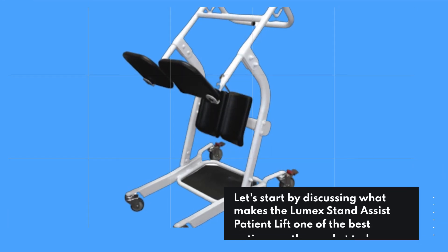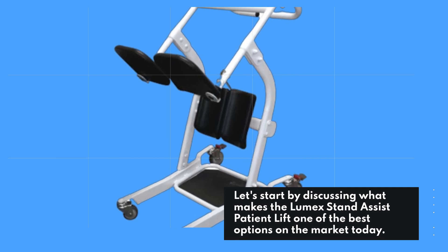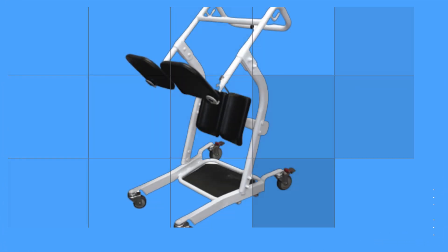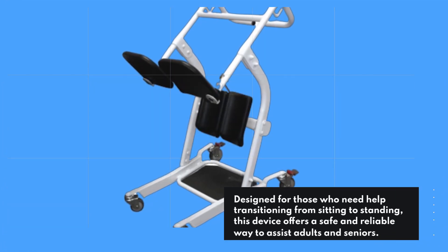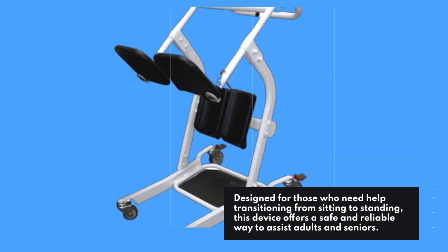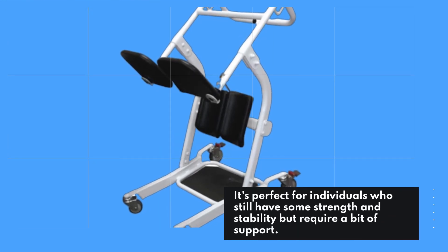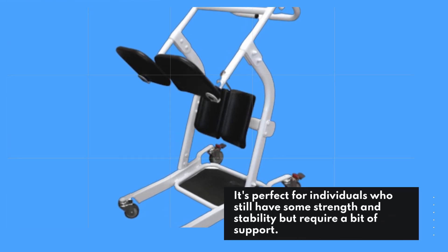Let's start by discussing what makes the Lumex Stand Assist Patient Lift one of the best options on the market today. Designed for those who need help transitioning from sitting to standing, this device offers a safe and reliable way to assist adults and seniors. It's perfect for individuals who still have some strength and stability but require a bit of support.